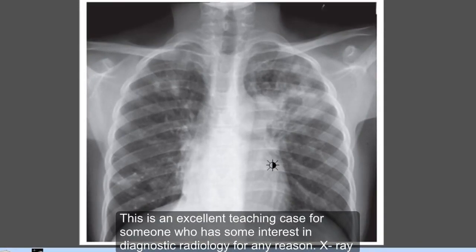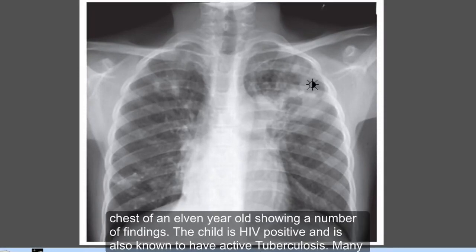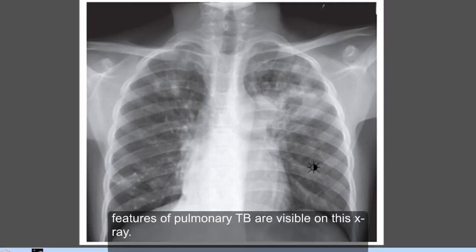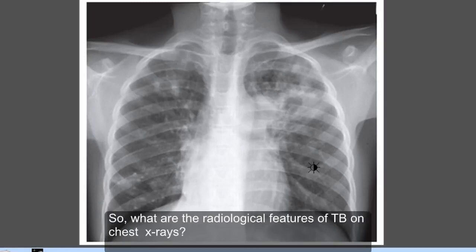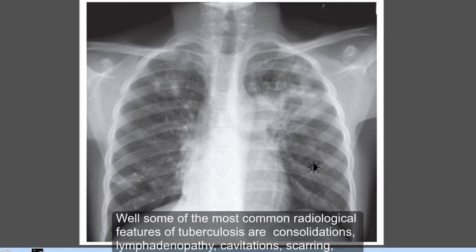For someone who has some interest in diagnostic radiology: a chest X-ray of an 11-year-old showing a number of findings. The child is HIV positive and is also known to have active tuberculosis. Many features of pulmonary tuberculosis are visible on this X-ray. So what are the radiological features of TB on chest X-rays?